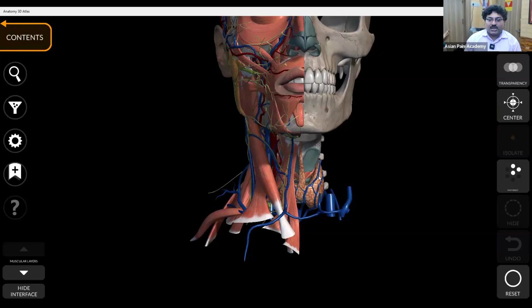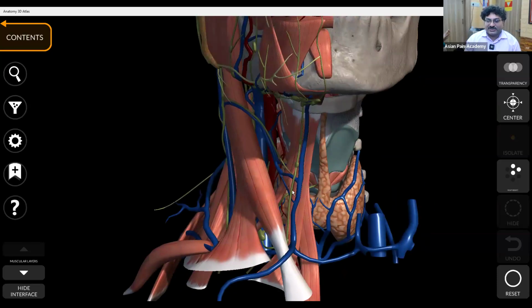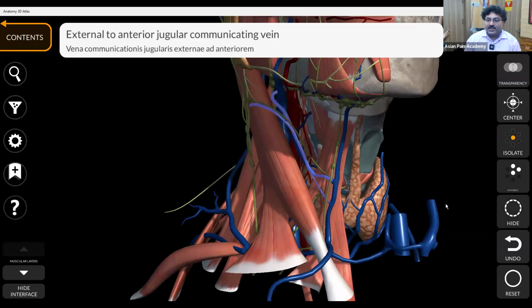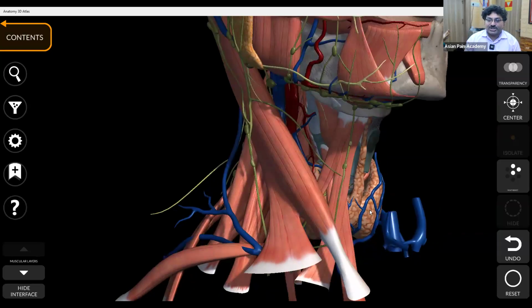Okay. So here I am opening the anatomy with all structures. With all structures, initially it's a little difficult to appreciate the exact structure, but this is what we can see under the ultrasound, because we cannot see specific structures. The small superficial vessels are usually hidden because of the pressure. If you give a little pressure, they will be blanched.